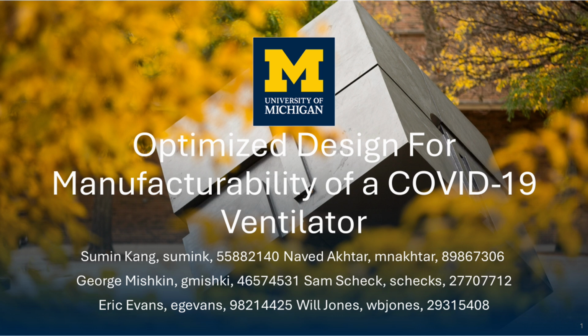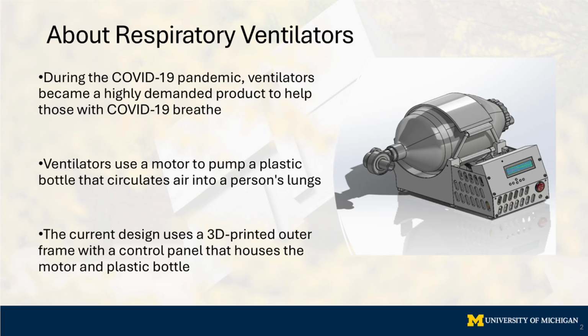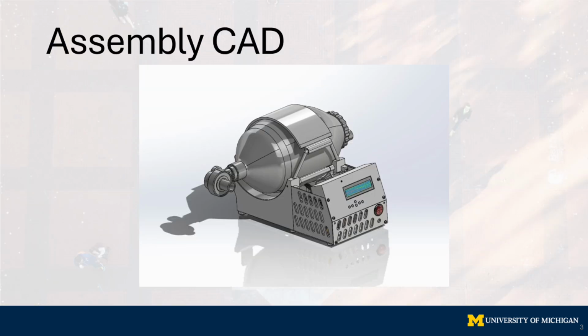Our topic is optimized design for manufacturability of a COVID-19 ventilator. Ventilators were in high demand during the pandemic to help people breathe. The design uses a 3D printed frame and a motor to achieve this function. Here's a quick view of the assembly CAD that shows the base view of the product.